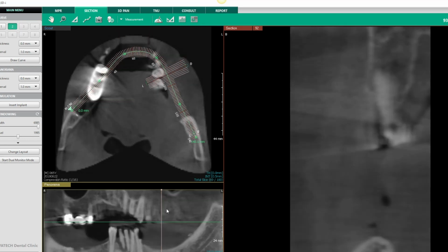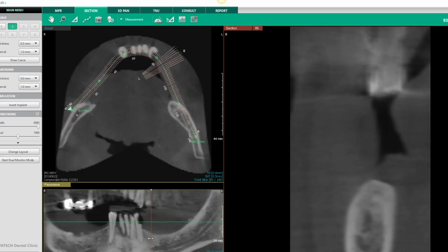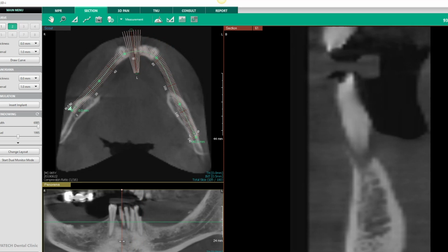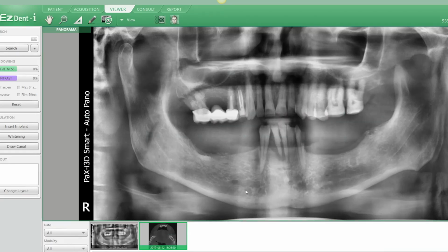Again, we'll be looking for vital structures. And again, if you don't have this CBCT scan and somebody's attempting to do an all-on-4 on you, all I'll say is that it's definitely not the right thing to do. We definitely do need a 3D scan on you. We can't just use a traditional panoramic X-ray. This is, I hate to say it, essentially useless when planning an all-on-4 procedure.